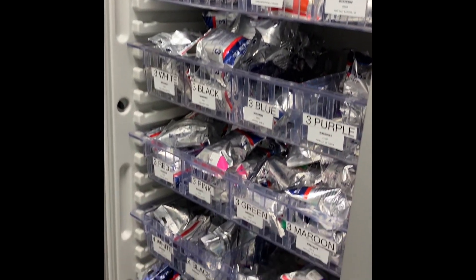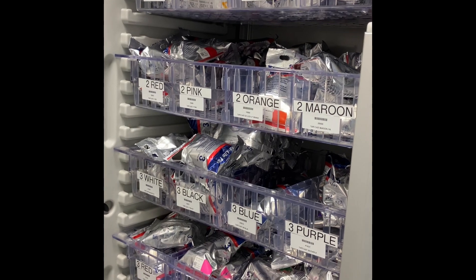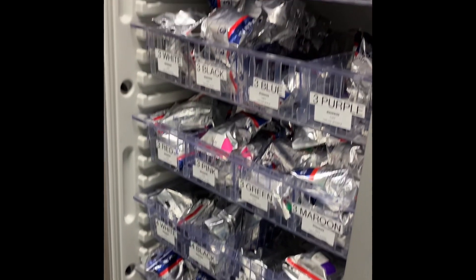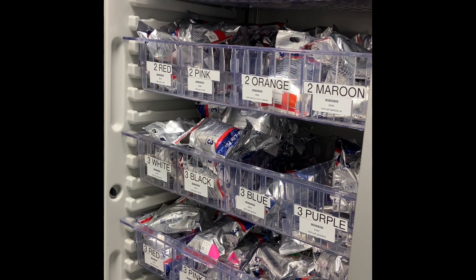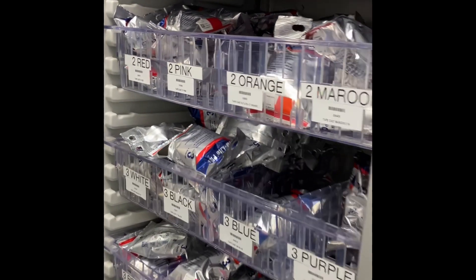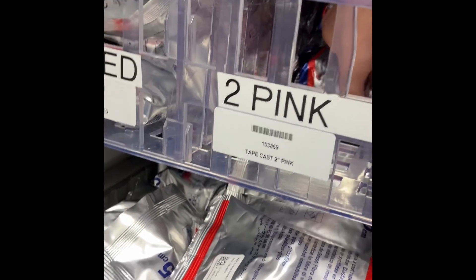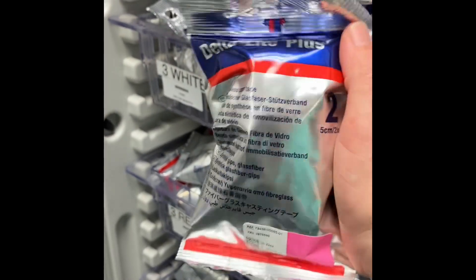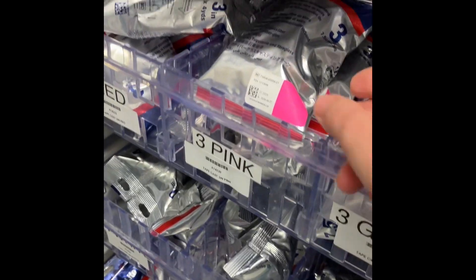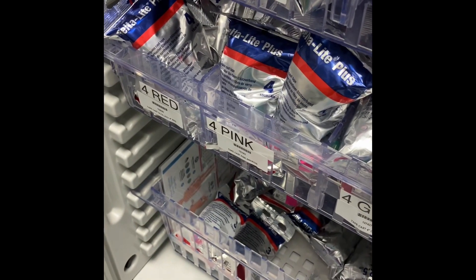This is the cart that holds all of our casting material. The most important thing you need to do is ask the patient what color they want. We are a pediatric hospital, so we have all kinds of colors because we want our patients to look cool. Once you determine the color, since these are small children, I recommend pulling four or five of each size. Our patient wants pink today, so I'm going to start with two-inch pink and also pull three-inch pinks — four or five of each. I might also pull a four-inch pink, but that's probably too big for our patient, though at least we can have it in the room in case the doctor needs it.